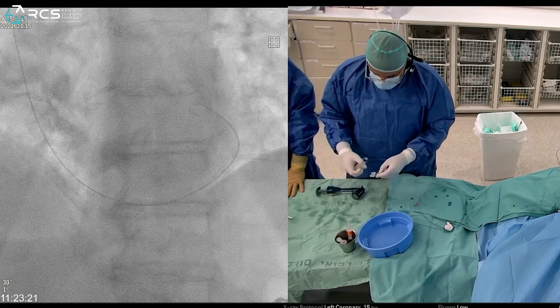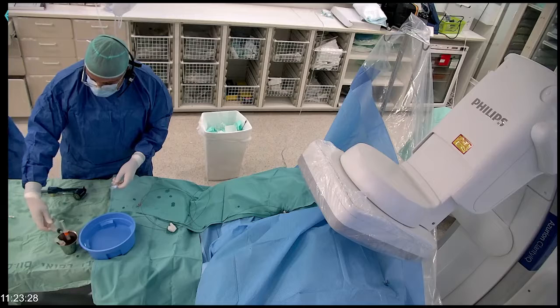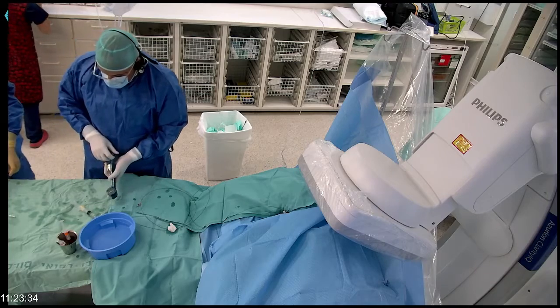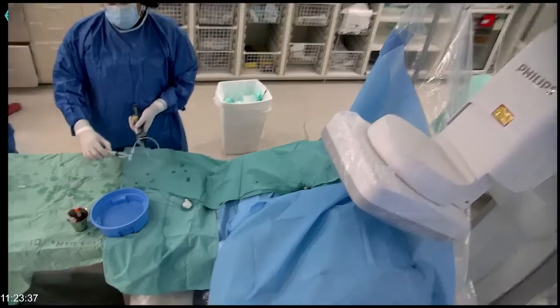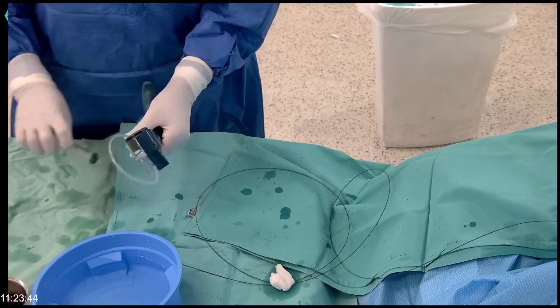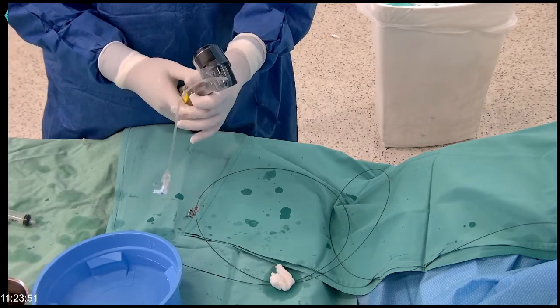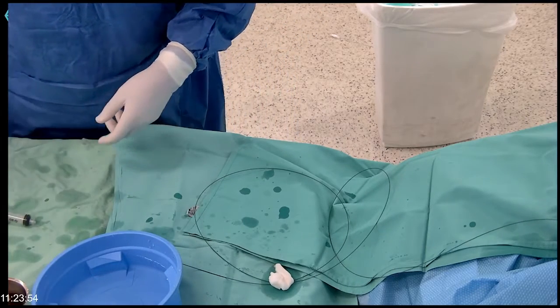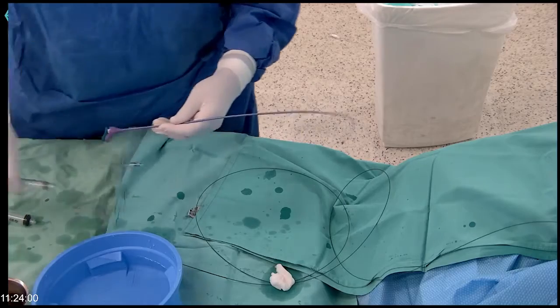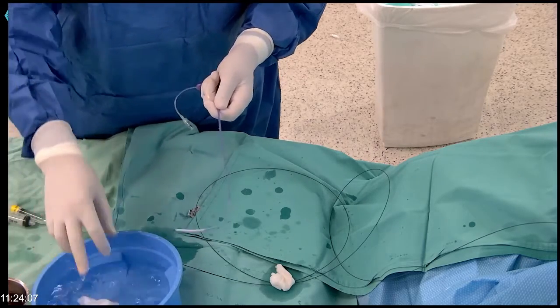The indiflator is filled with 20% contrast: two mls of contrast filled to 10 mls with saline — only 20% contrast — put into a 20 ml Luer-lock syringe and sucked into the indiflator. I now have the indiflator with a three-way stopcock at the end, filled with 20% contrast and 80% saline. We have the Acuity Pro catheter, a dedicated catheter for the coronary sinus, which I flush.